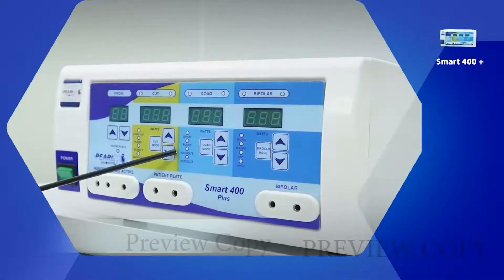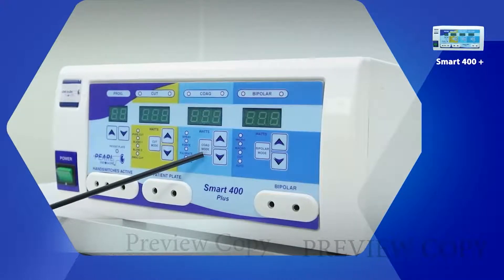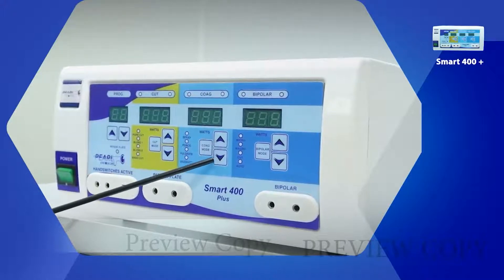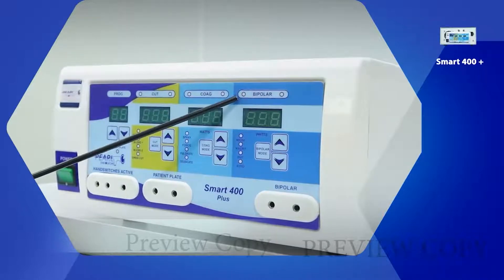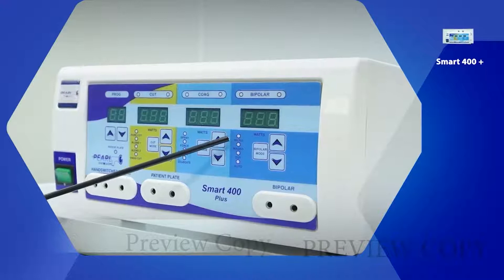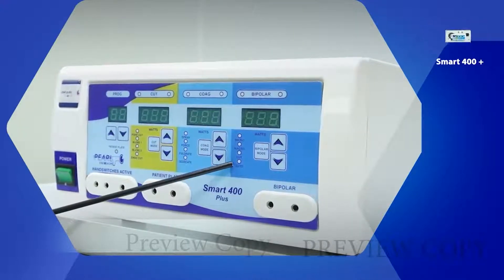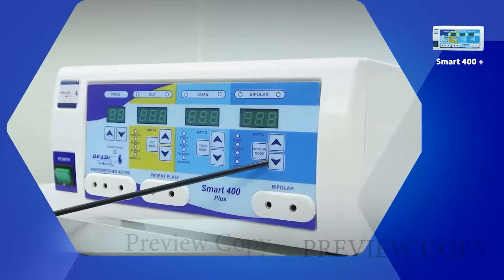These are the coagulation modes. This is the coagulation mode change button and the power up and down button. These are the four bipolar modes: micro, macro, cut, and auto. This is the bipolar mode change button with the power up and down key.